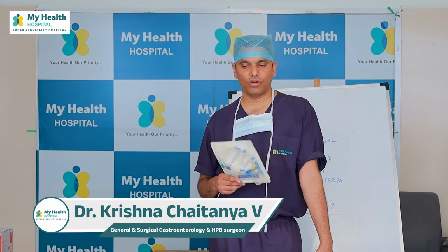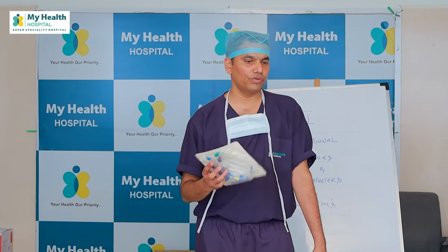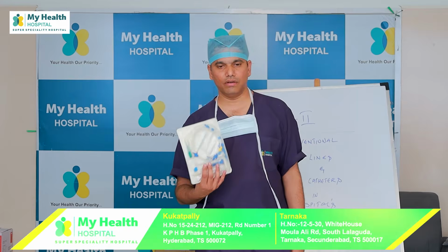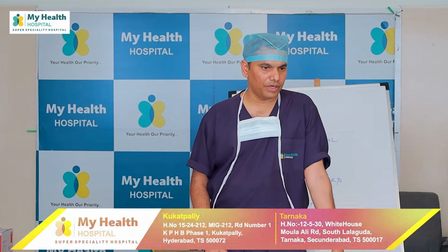Okay, what is the need to measure CVP? One lumen we also use for feed. One lumen we use for pushing fluids. Okay, done. And then CVP measuring.